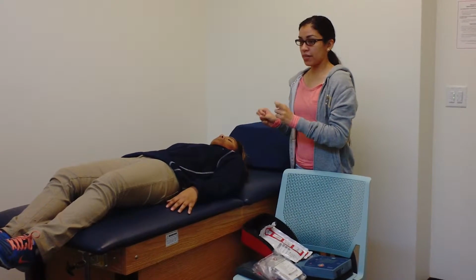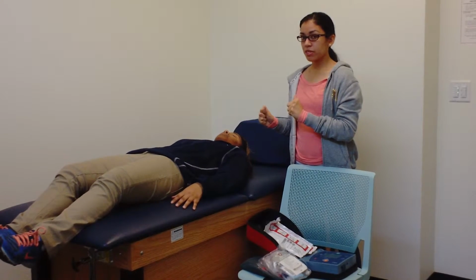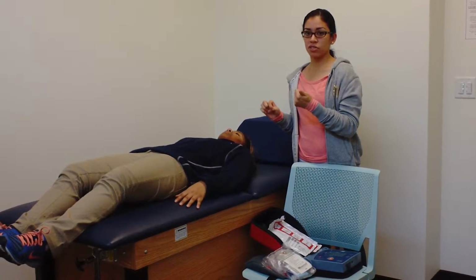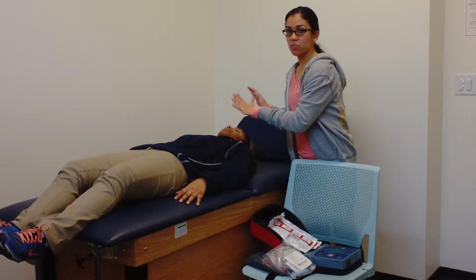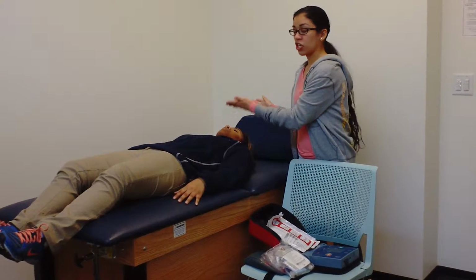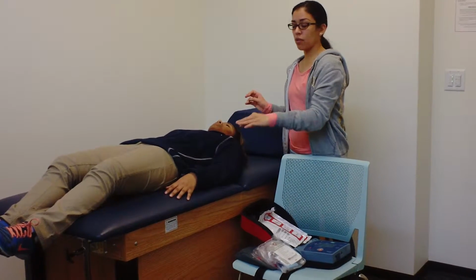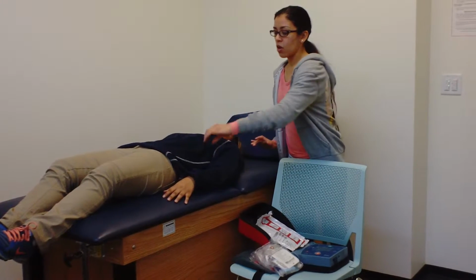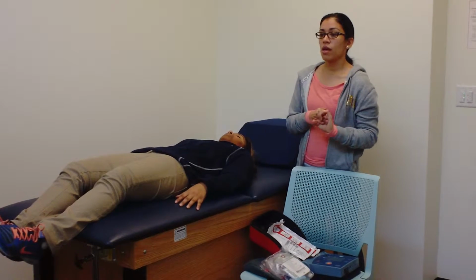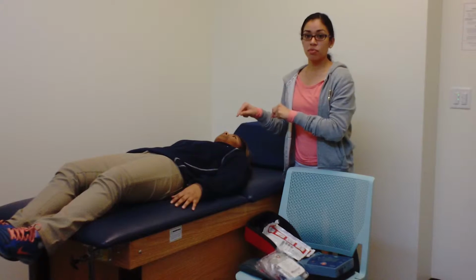Now, what I'm going to do next is proceed with CPR. But before I proceed with CPR, I want to check the person's pulse, ABCs, airway, breathing, and circulation. So I would check the patient's breathing. Are they breathing in the manner that I want them to? Do I need to adjust their head to assess the breathing correctly? I want to be able to see their chest rise, and I want to analyze their pulse either at the carotid or the radial pulse, whichever is accessible and safe for me to do so. If they still have an irregular pulse, I would start with CPR with chest compression.